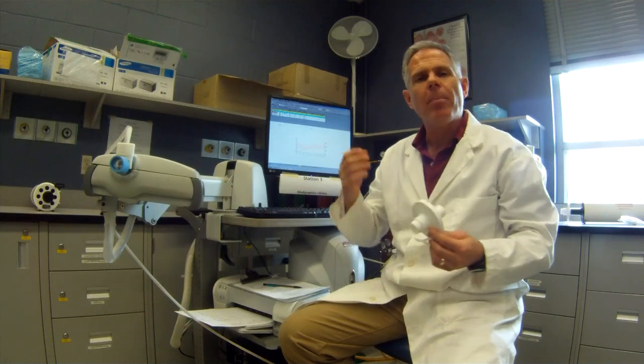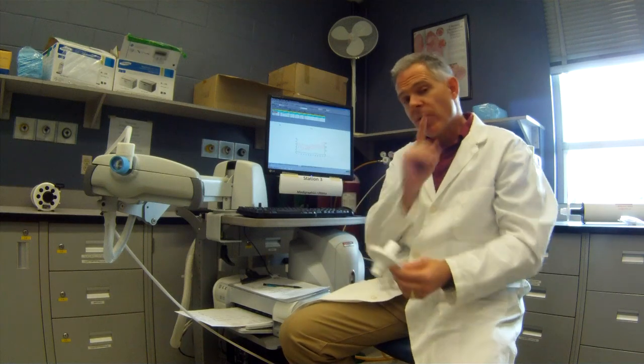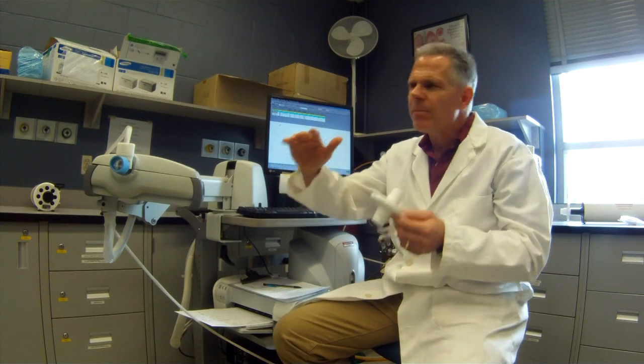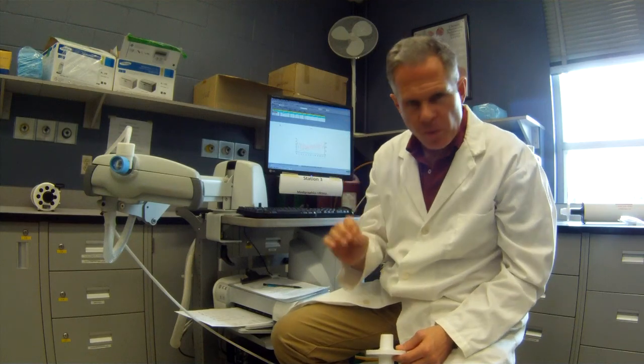All right, so this is where we're going to determine how effectively our patient can blow air in and out of their lungs. Okay, so the trick to this test is that we want the patient to be breathing in at about 50% of their vital capacity. So that's about 2 liters for most of us, at a rate of about 90 breaths per minute.